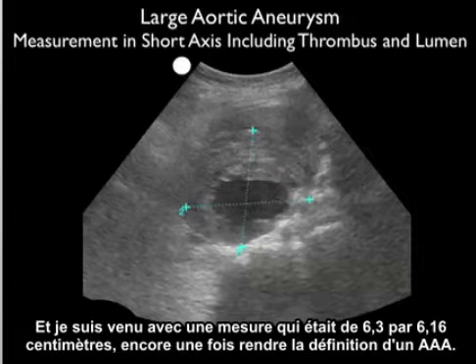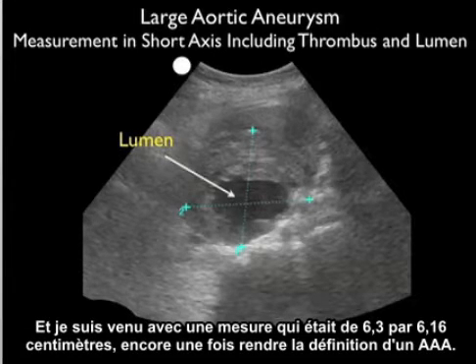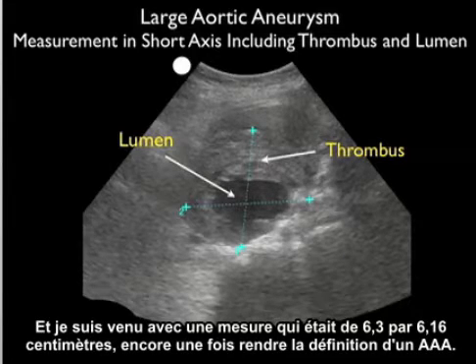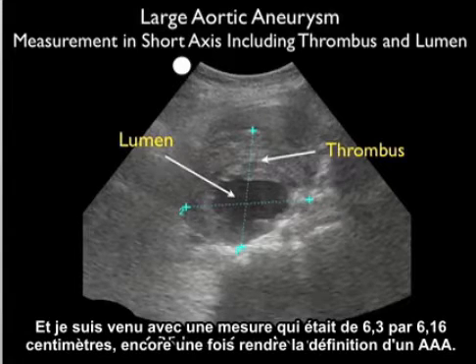Next, we're going to measure this triple A, putting the calipers from anterior, posterior, and laterally, trying to add the lumen and the thrombus to our measurements. I came up with a measurement of 6.3 by 6.16 centimeters, again making the definition of a triple A.